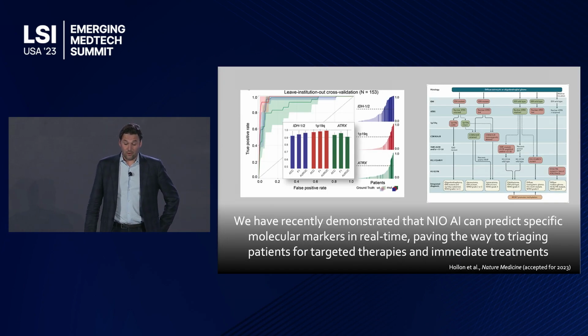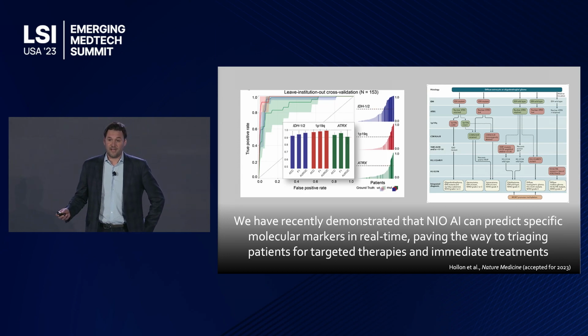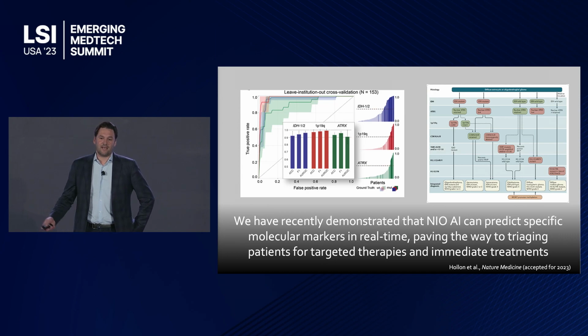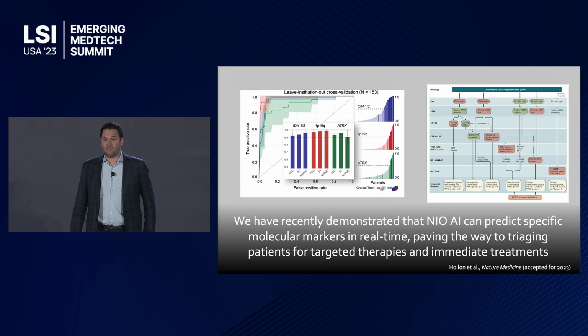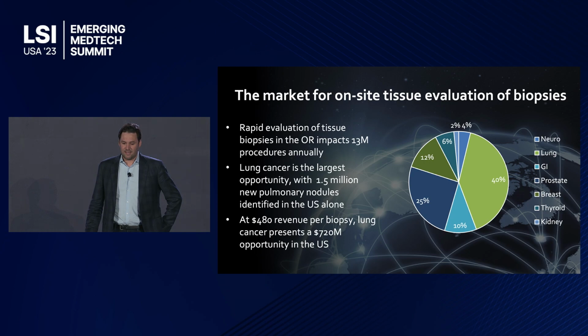We have some exciting work going on in the lab that's not clinical at this point, but we are showing that we can go beyond detection of cancer to actually identifying what the key mutations are in the specimen. This uses purely morphologic features instead of sequencing. It's therefore rapid and, for the first time, available at the time of surgery. This becomes very exciting as we think about the future of bronchoscopy, where the pulmonologists are trying to combine diagnosis and treatment in a single procedure. There are technologies in ablation, and there's local delivery of chemotherapies. Having accurate diagnosis in the OR will be key enabling for these applications.